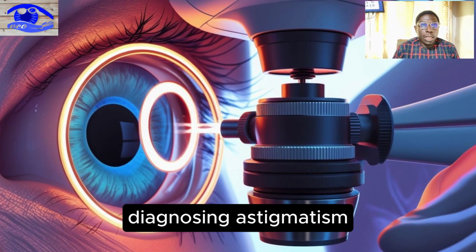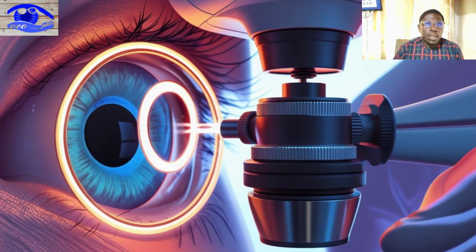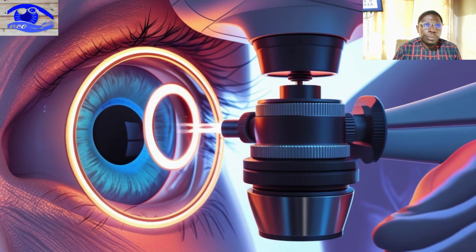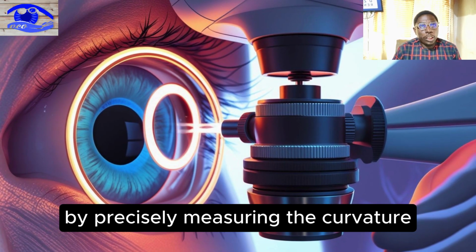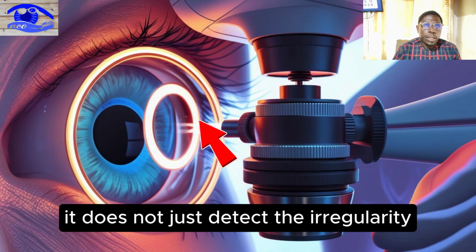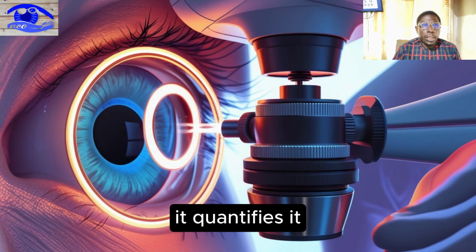Diagnosing astigmatism. This is where keratometry steps in by precisely measuring the curvature in multiple directions. It does not just detect the irregularity, it quantifies it.